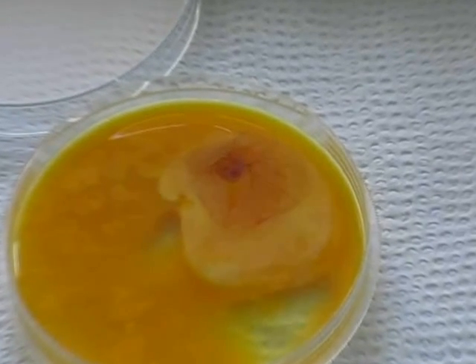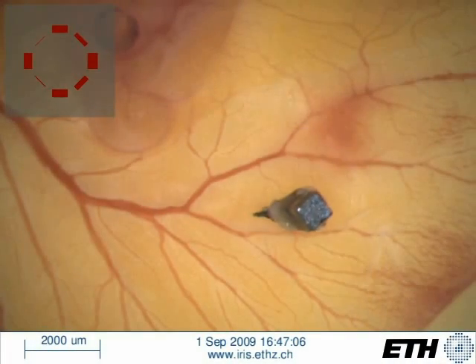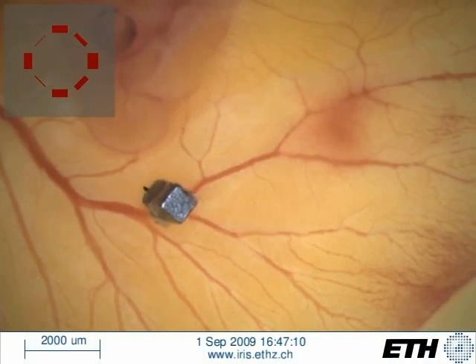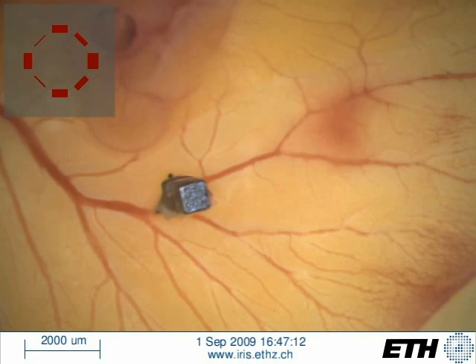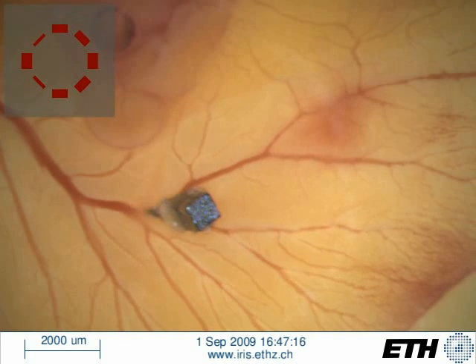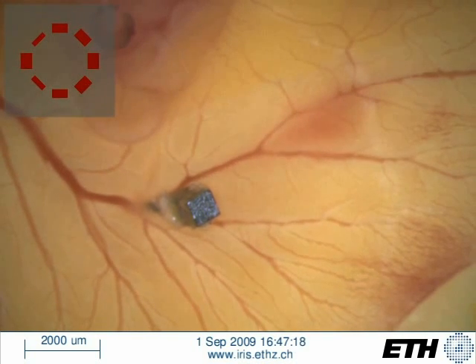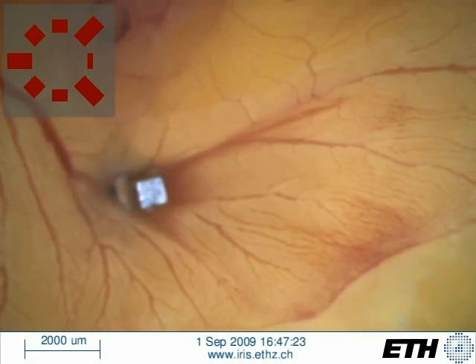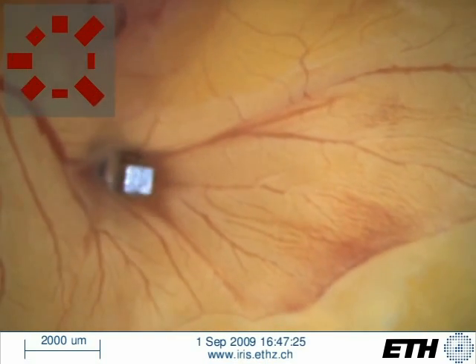A chick chorioallantoic membrane has been demonstrated to be a viable model tissue for surgical retinal research and simulation. We see here a permanent magnetic device equipped with a needle tip being used to puncture a blood vessel. This demonstrates that an untethered magnetic agent is able to be manipulated with enough dexterity and force to potentially deliver enzymes or other clot-busting agents to the delicate structures of the eye.